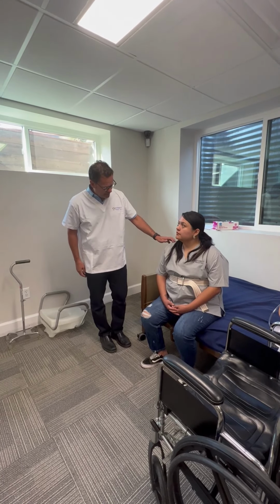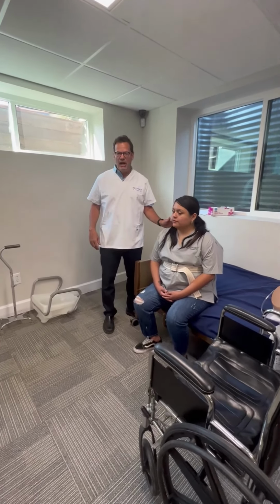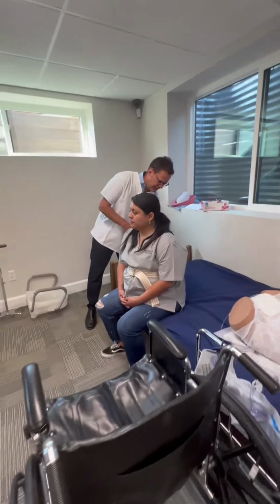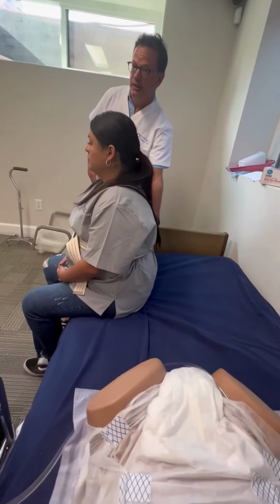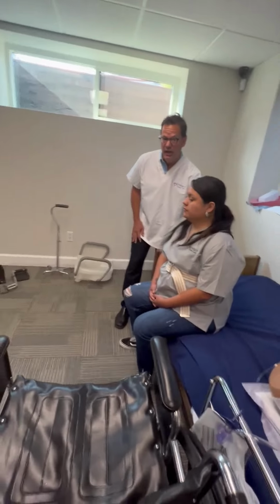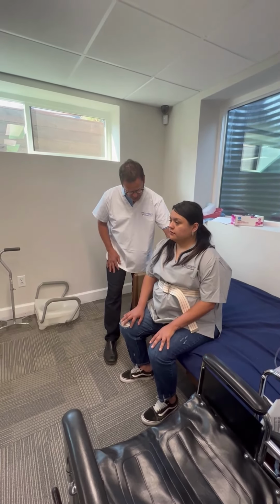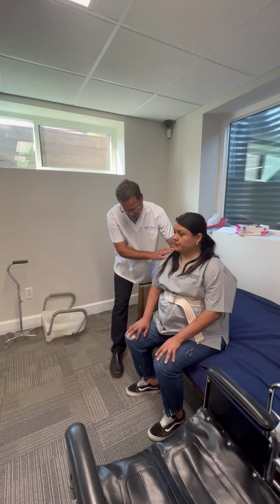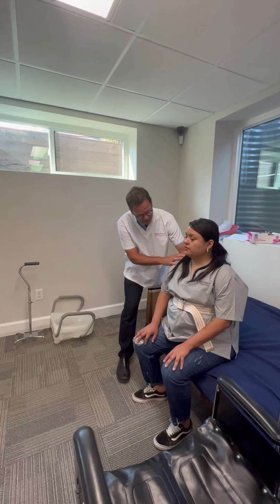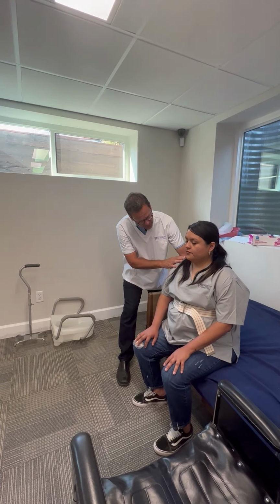So let's get a transfer. I'm going to do 2 transfers. The first transfer, I am not assisting Giselle, and so I'm going to take a position on the belt. I have a handhold in the back, and I just have a close position to her, and I'm going to ask her just to stand up. That's going to be our first instruction. So Giselle, when you're ready, I am going to count to 3, and we're just going to stand onto your feet, and we'll transfer to this chair. Okay. So 1, 2, 3.